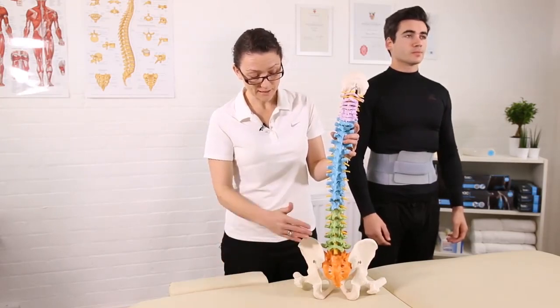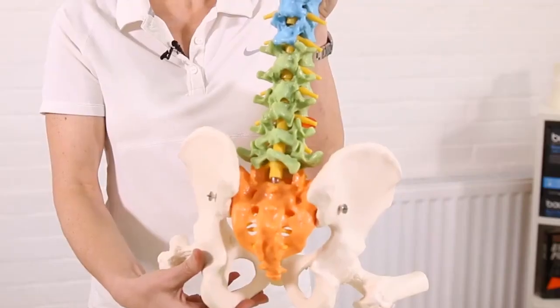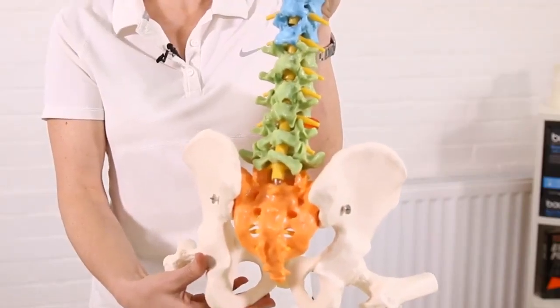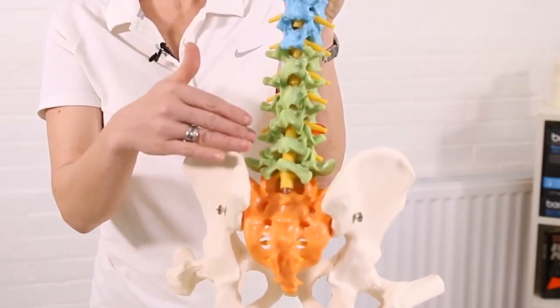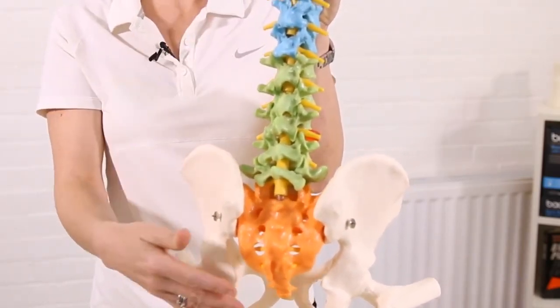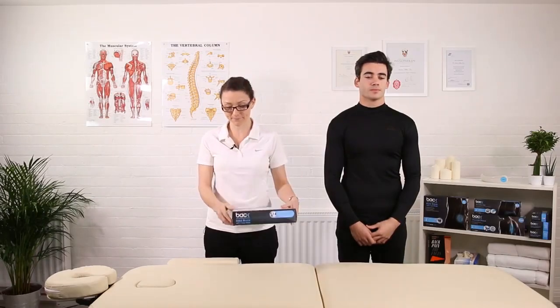The brace we're going to talk about today is particularly for the lower back. There are many parts of the back that can cause pain — the muscles either side of the spine, the joints themselves, or the ligaments around the joints.